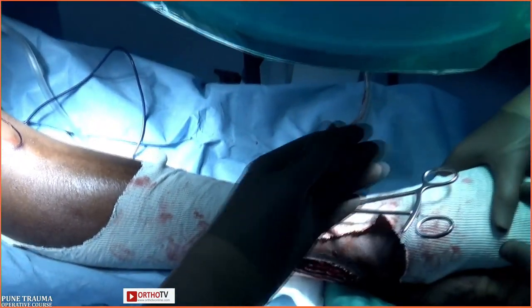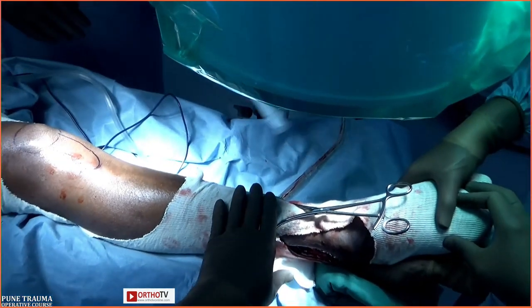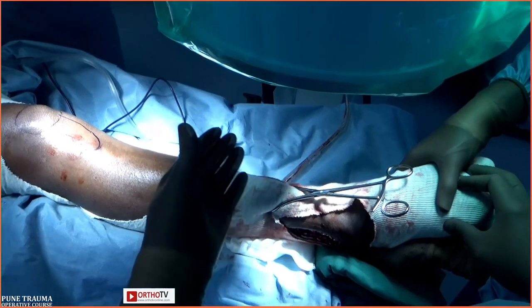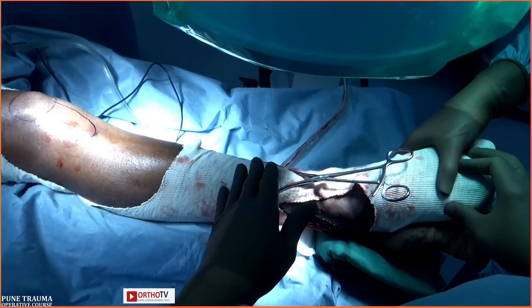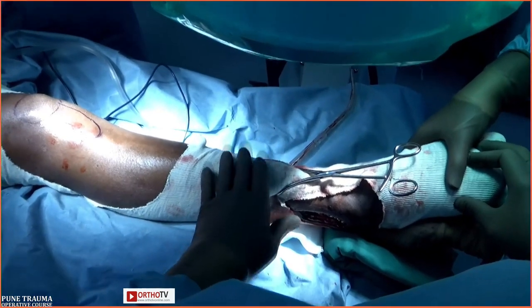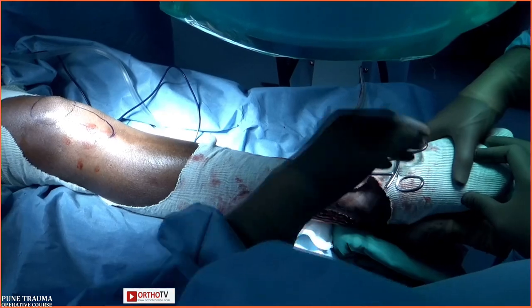Now you can see the lateral X-ray also. Now in spite of this, in the AP X-ray, it looks good. You may get an anti-curvature or retro-curvature in the distal tibia in the lateral picture. Therefore, before you pass a guide wire, you must correct this. So this is the lateral picture.